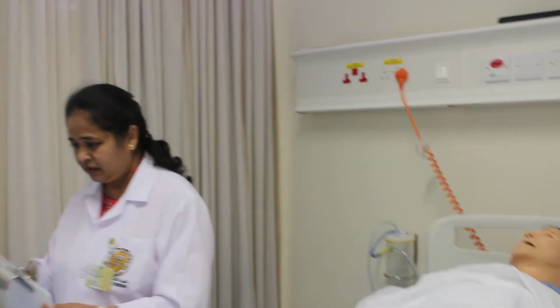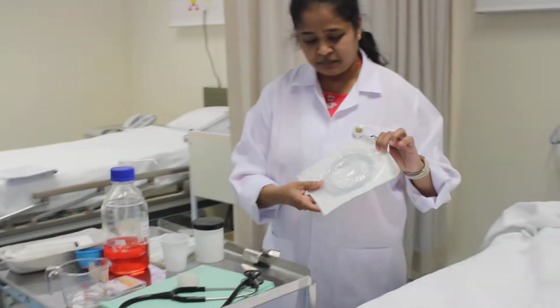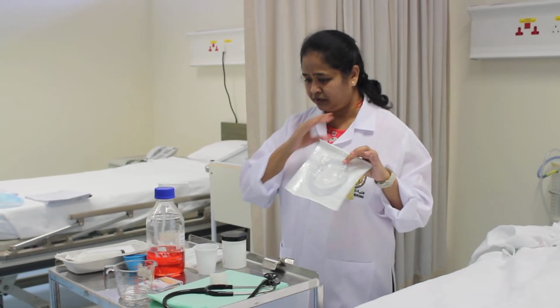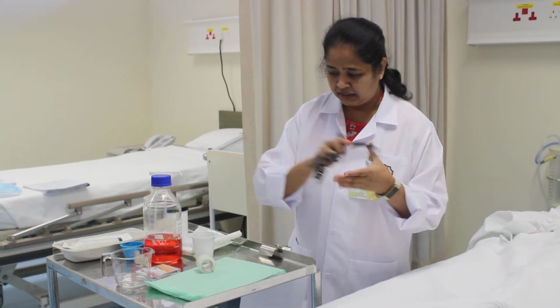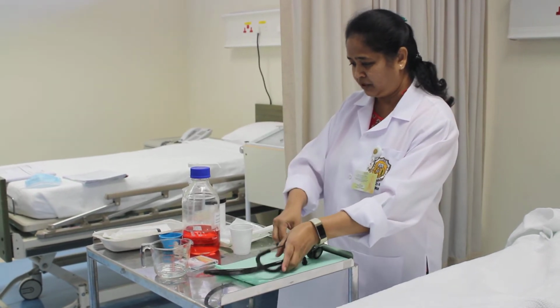So when I come, what are all the things I need? Okay, this is called an NG tube. This is a nasogastric tube. For feeding we are going to use it. And I need a little Vaseline just to facilitate inserting it. I need a stethoscope. I need an info sheet. I need to have micropore.